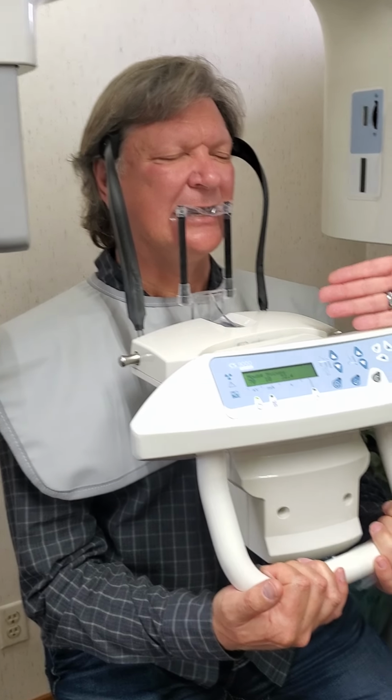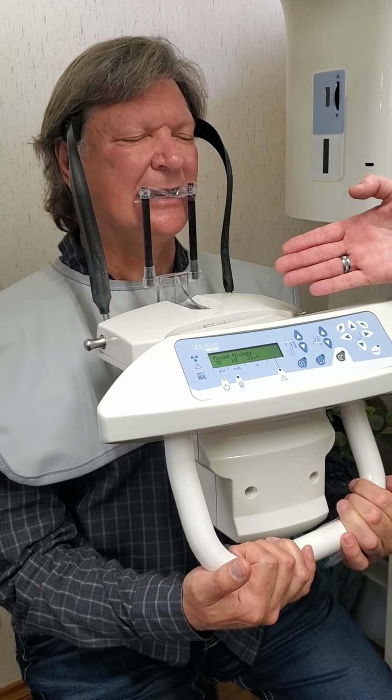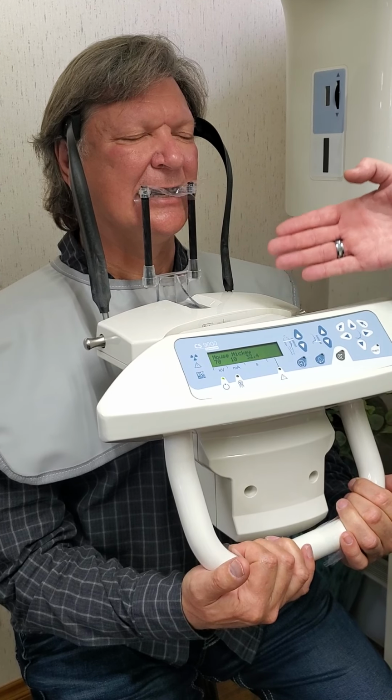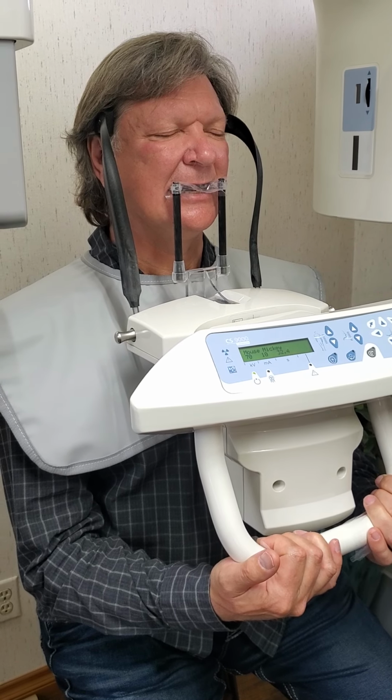Now the patient is fully set to do an upper tooth, arch, or quadrant. Then you would instruct your patient, okay, I'm going to start the scan at this point. All you have to do, just keep your eyes closed. I tell them to keep their eyes closed because otherwise, as the machine's going around, they have a tendency to want to follow. Watch it. If they keep their eyes closed, they just hear the machine going, but they're not trying to follow it with their head.